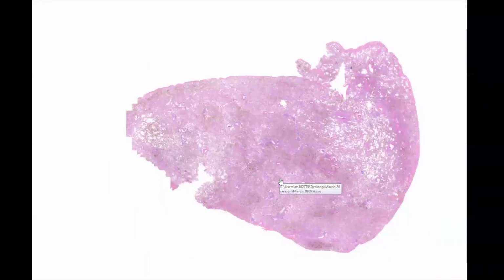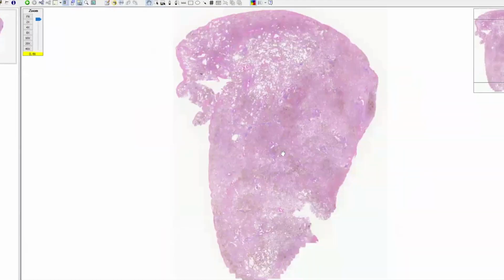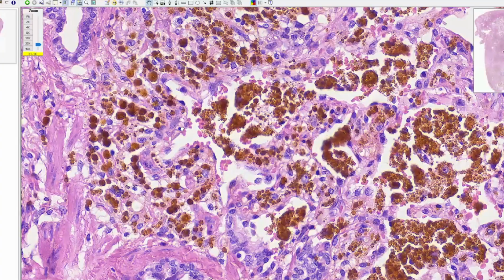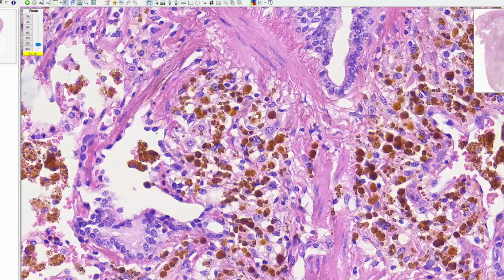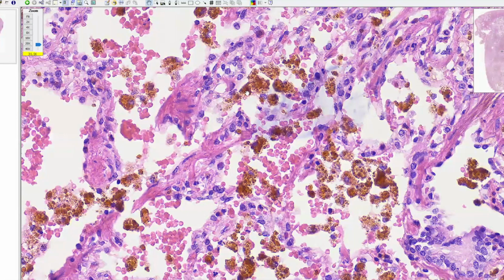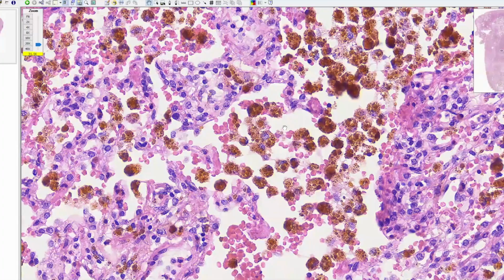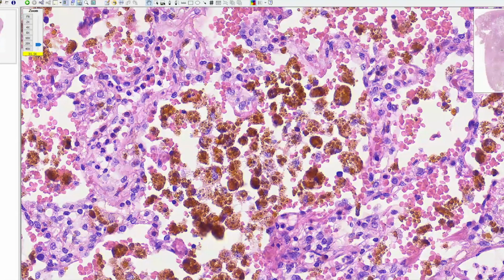And then just last for comparison here. So this is actually a different pigment here, and you can see that it looks different than both the smoker's pigment as well as the pigment that you see in cannabis smokers. It has, once again, this more chunky appearance, but it's larger globules of material, and you don't really see that kind of background of fine staining. It has this lighter brown character to it as well, and it's filling these alveolar spaces here.